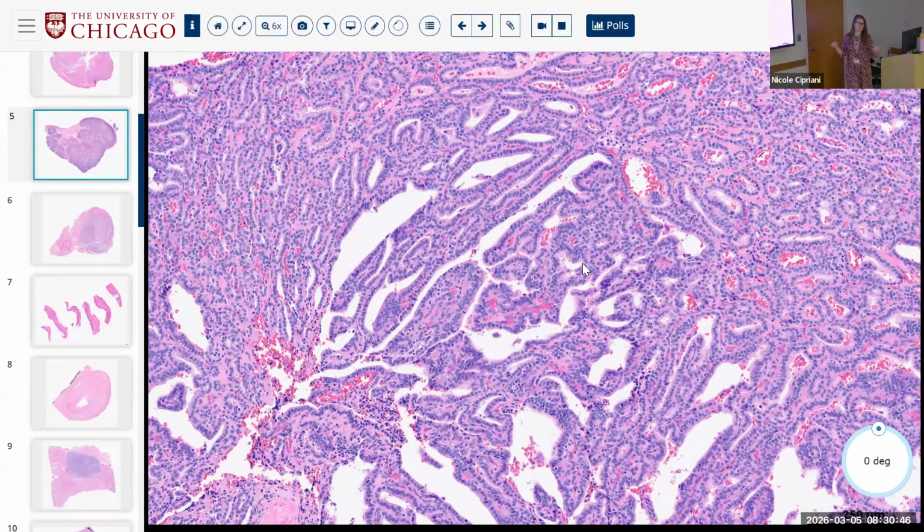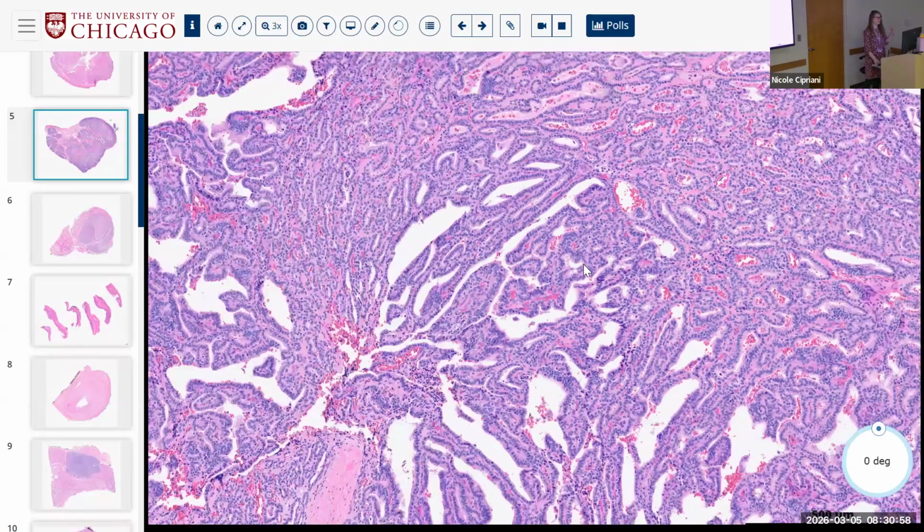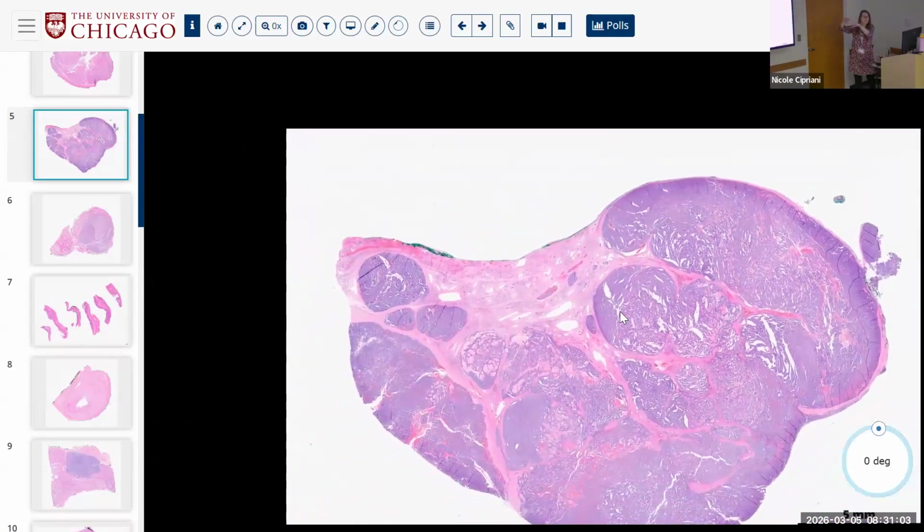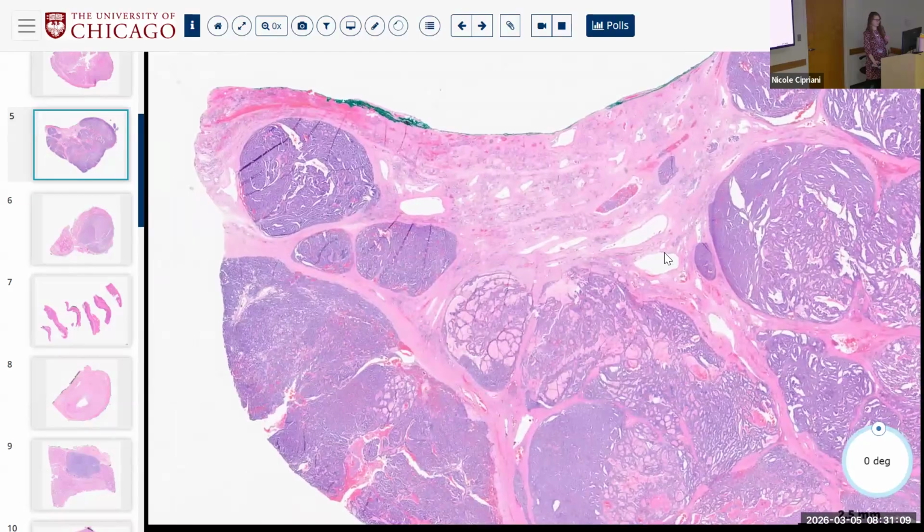Any growth pattern can be seen in any of those, from papillary to follicular to solid, right? This is, I think, a good example of that. So we have to take all things into consideration: the nuclei, the growth pattern, the genetics, the overall morphology, right? This has the sort of lobulated, broad-based pattern of invasion of a follicular pattern neoplasm. It does not have the nuclei of PTC.